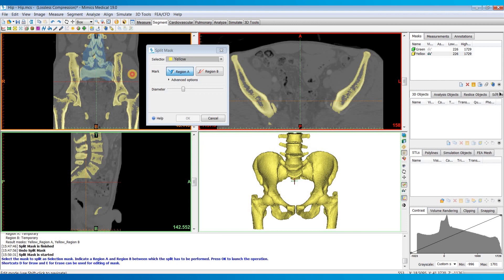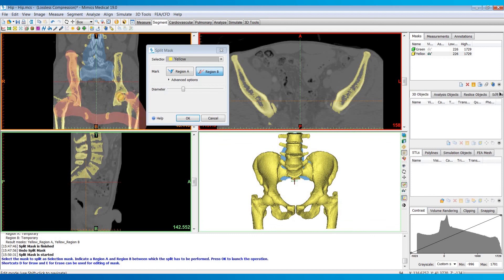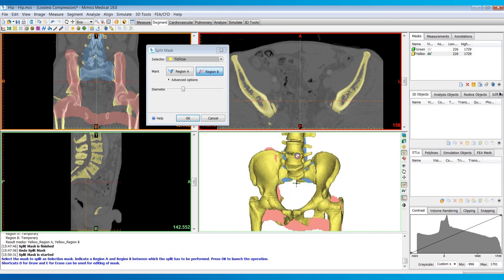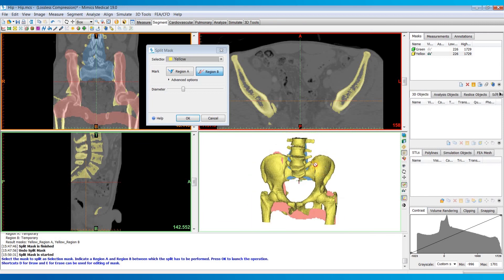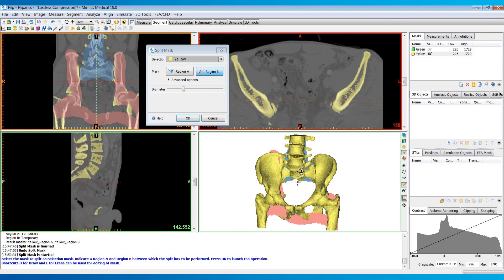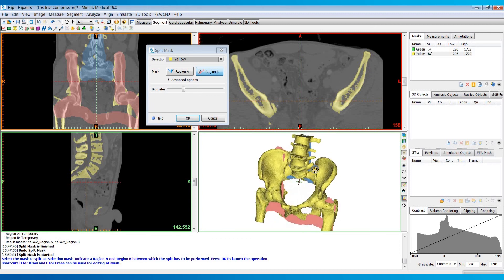You don't have to be exact or get every single portion of it. Then I'll mark the pelvis and the femurs in region B. You typically only have to do maybe a couple slices depending on your images and what you're trying to split off. It basically uses your markings as well as the image intensity gradients to try to find the boundary between the two structures and separate them.